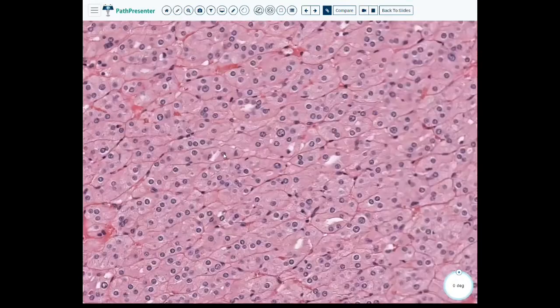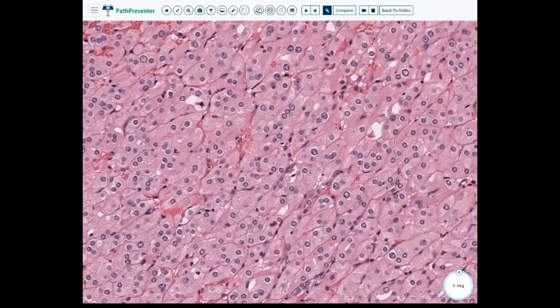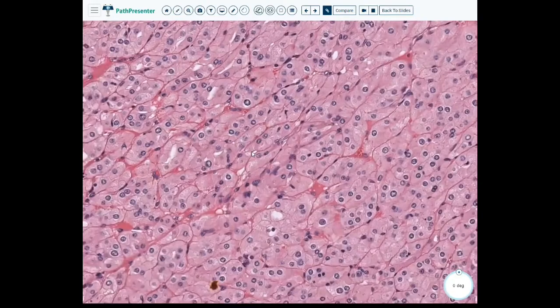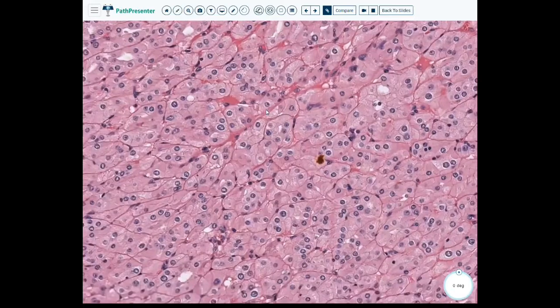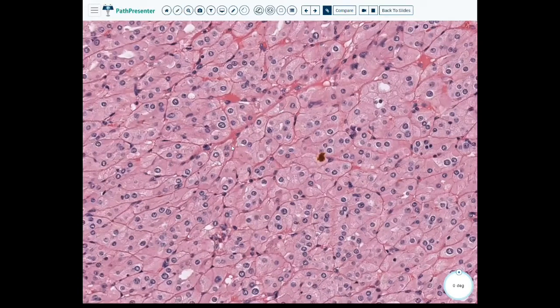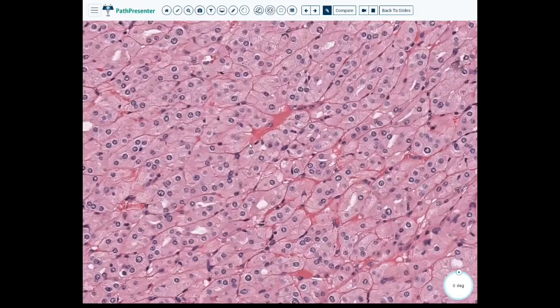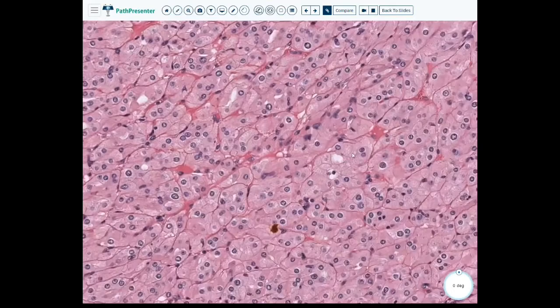And you'd want to add in there some other oncocytic lesions that we didn't cover in our lecture time as well. So that would be things like maybe you want to think about succinate dehydrogenase deficient RCC, and always consider your hereditary lesions, but it doesn't really matter where I'm going in this.